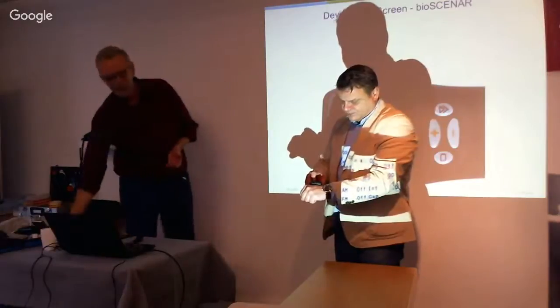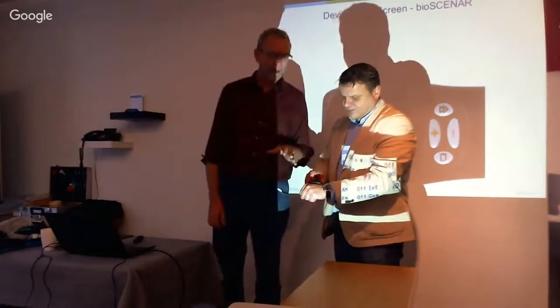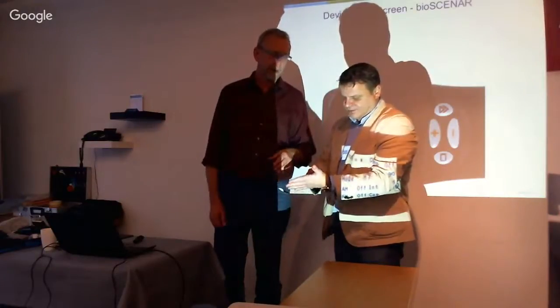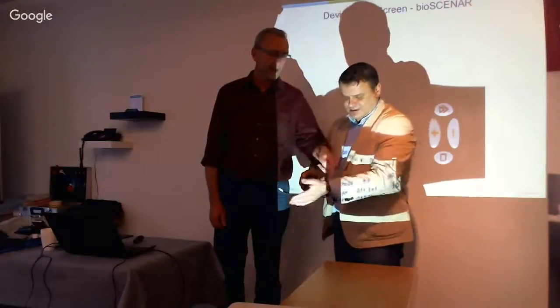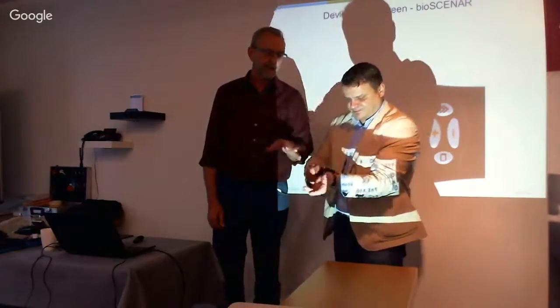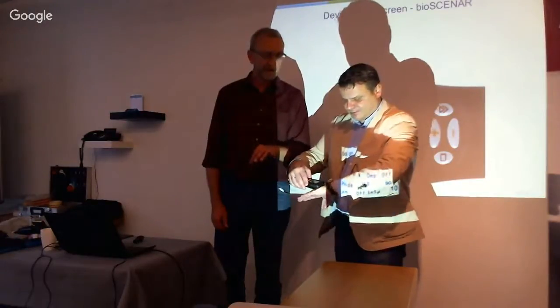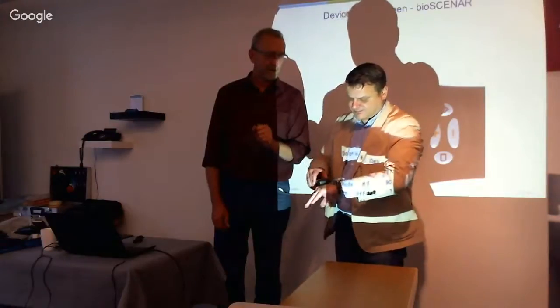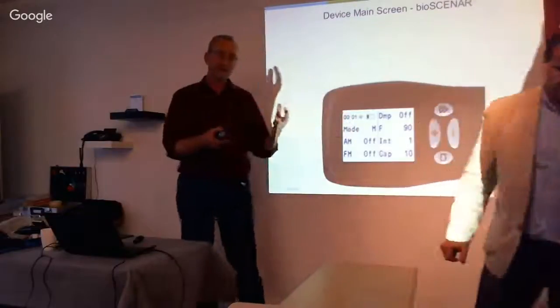Can you feel it? Take it up bit by bit, carefully. If you turn it up too high, you will feel the pain. You don't want that. If you put it on your fingertips now, it will hurt you because this part of the skin is not as sensitive as your fingertips. It's really different. Good. So you get an idea what the feeling is.